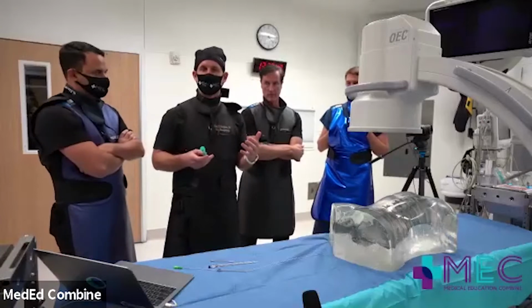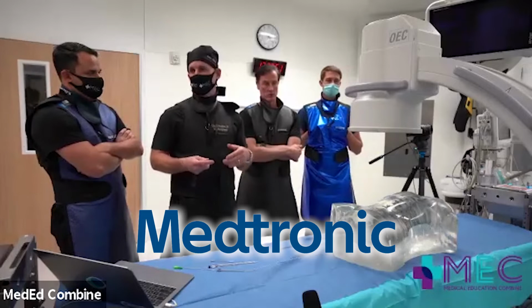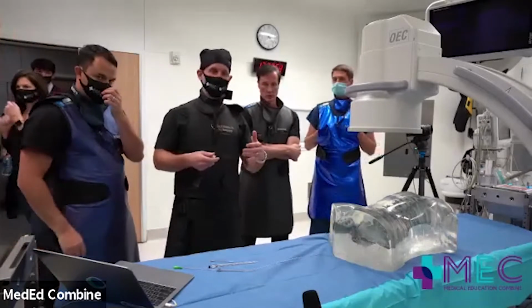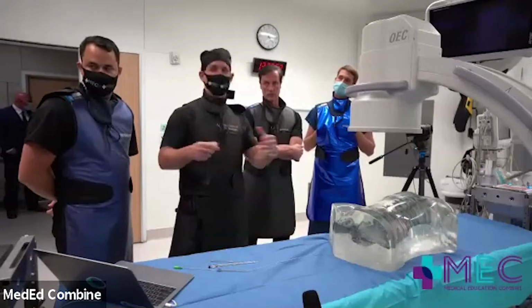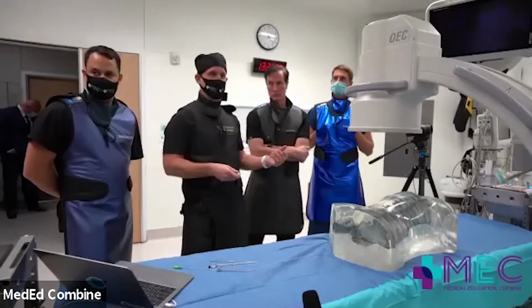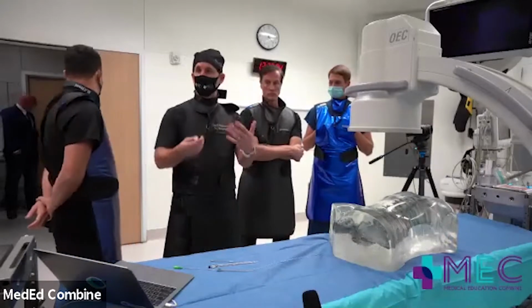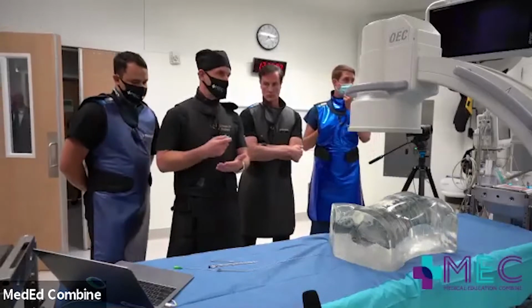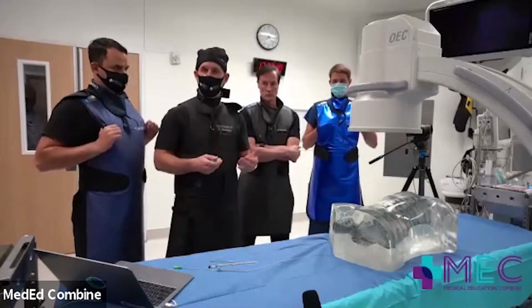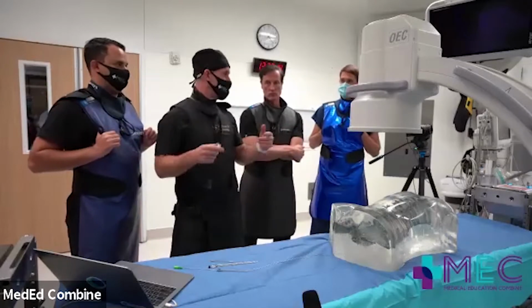When you look at a stim company, you really need to start to think about what your patient's needs are, right? If you have a patient that doesn't care what their incision looks like, doesn't care how big a battery is, doesn't care how long they have to charge, then it's really not that big of a deal. But I don't think those patients exist, right? All my patients want what they want. They want to have a small battery. They want an easy charging system. They want it to last forever. They want it to work the same way it did as the trial. I mean, on and on and on.